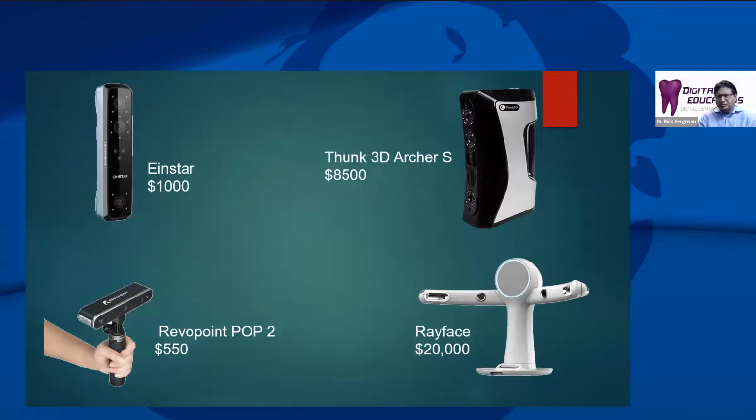And then a newer machine that's on the market, which I actually don't have, Dr. Reynal Gonzalez, who's literally next door to us, has one of these. It's the RayFace from RayScan, and this is about a $20,000 machine. Very fast scan. The patient sits down in front of it, and it scans them automatically. And we'll see what the result of that scan looks like. So this is getting some traction in the dental world, and I expect to see more folks acquiring this machine. It is very good, but it comes at, of course, a much higher price point.